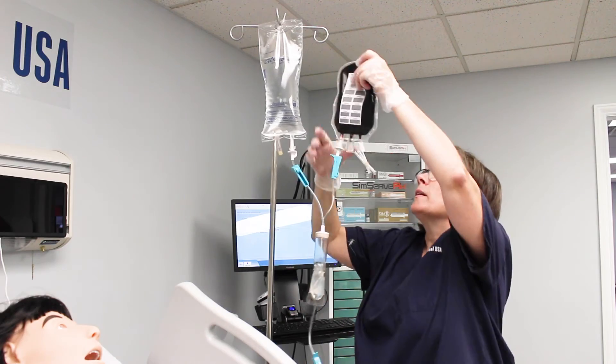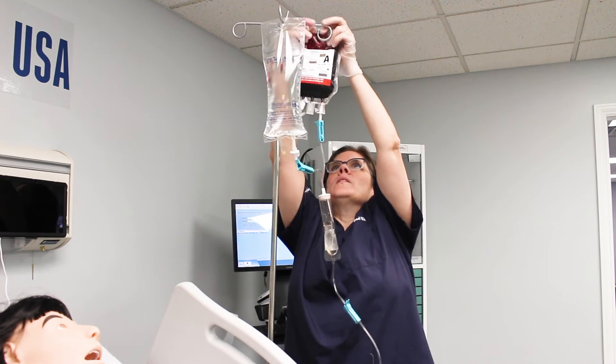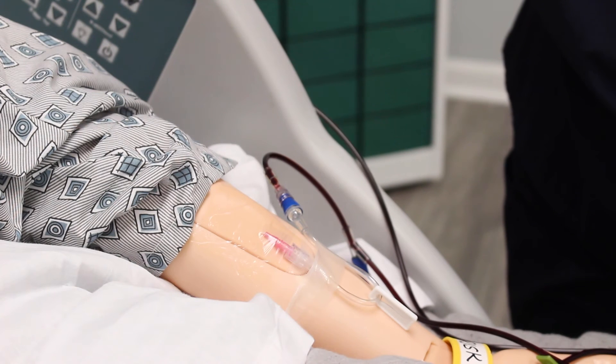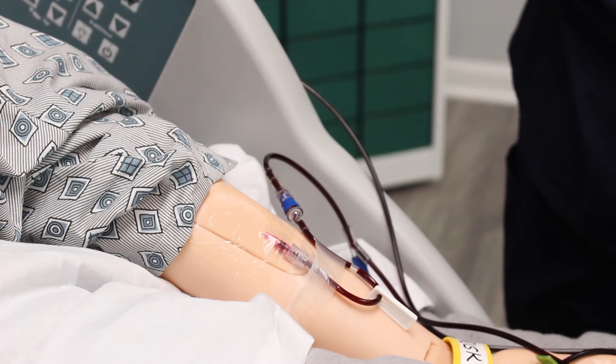SimRx signature blood bags should not be infused into mannequins as damage to the tubing system may result. Whereas SimRx stainless blood bags are recommended if simulated blood must be infused into mannequins or skills trainers.